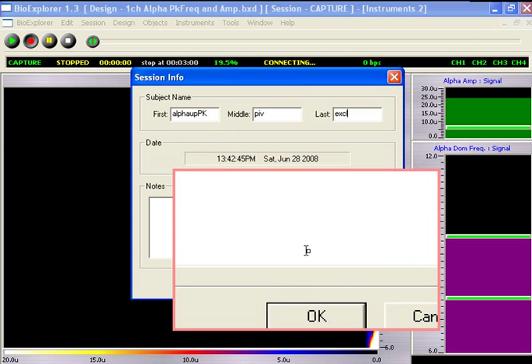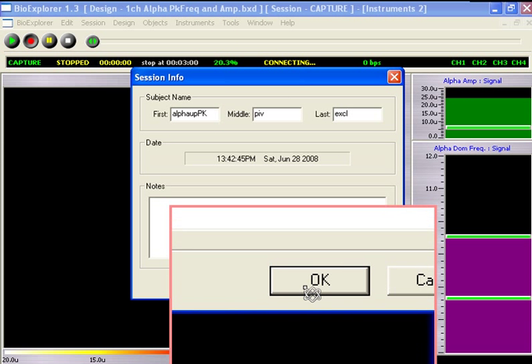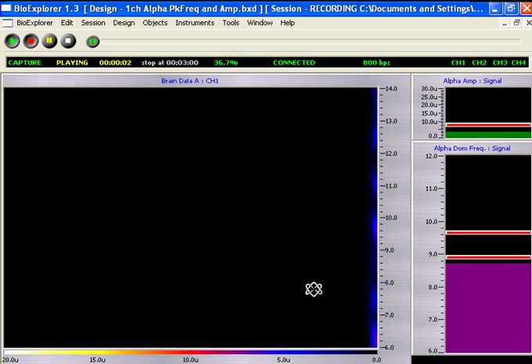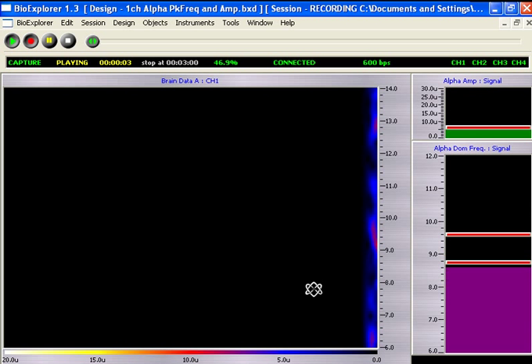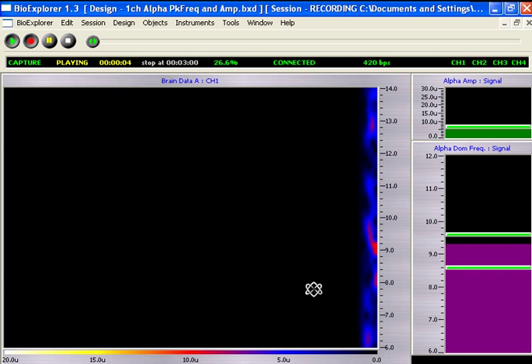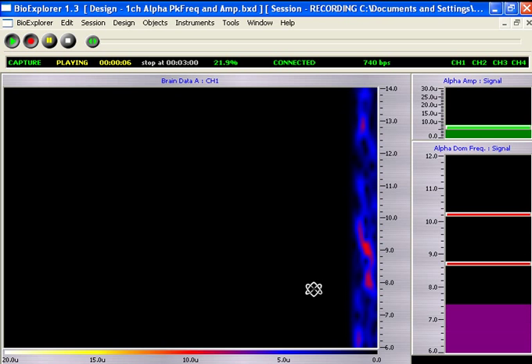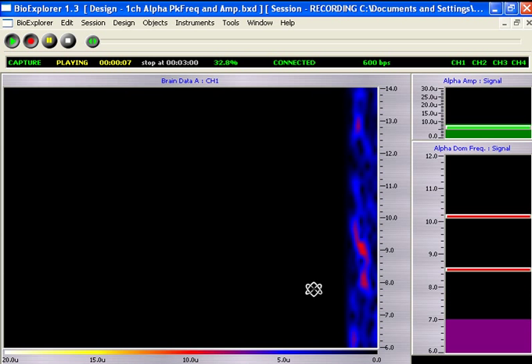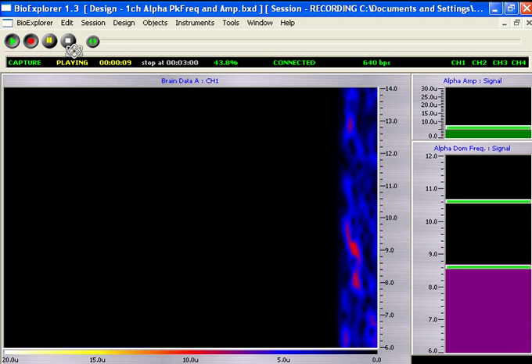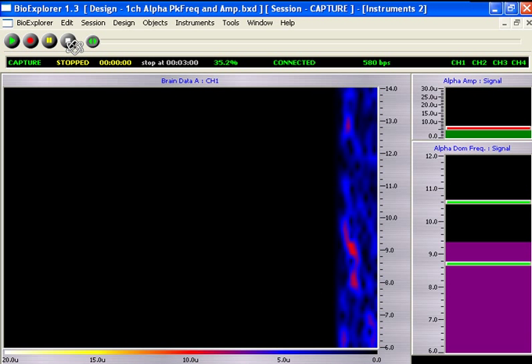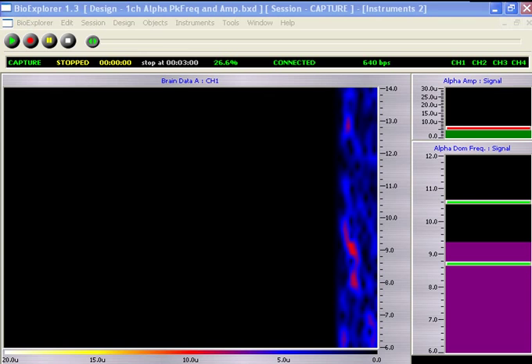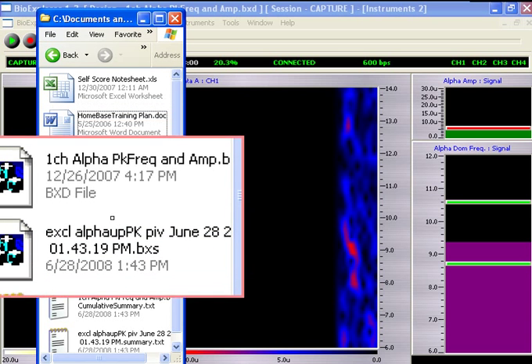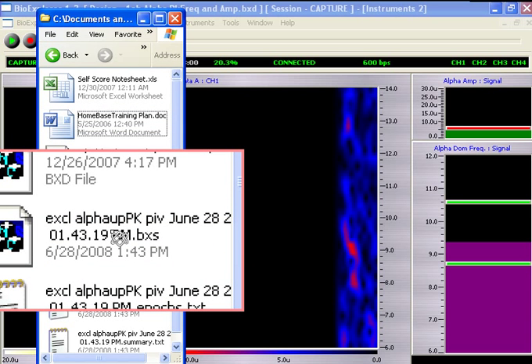These fields will become part of the file's names. Now it's recording. And when the session is finished recording, when we look back at the target folder, we can see the new files that were generated. Here's the session recording and the epochs text file named with the additional information we've entered.